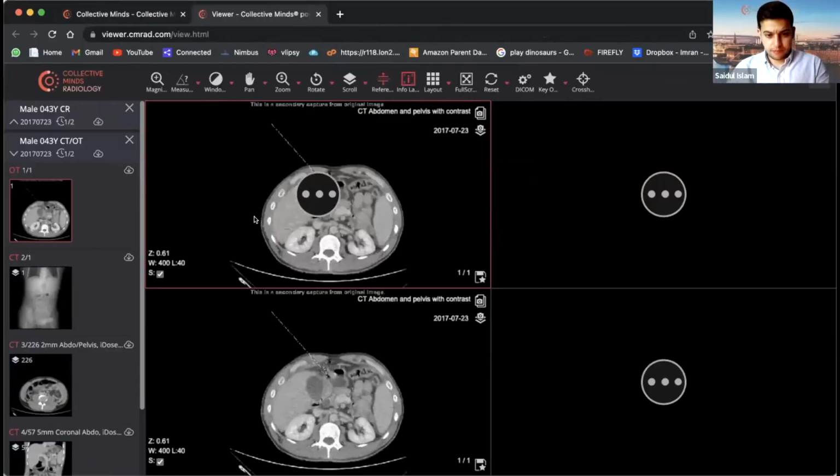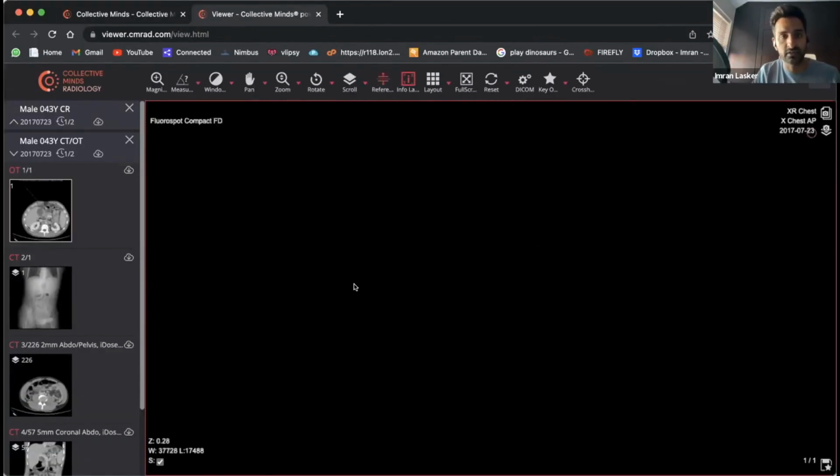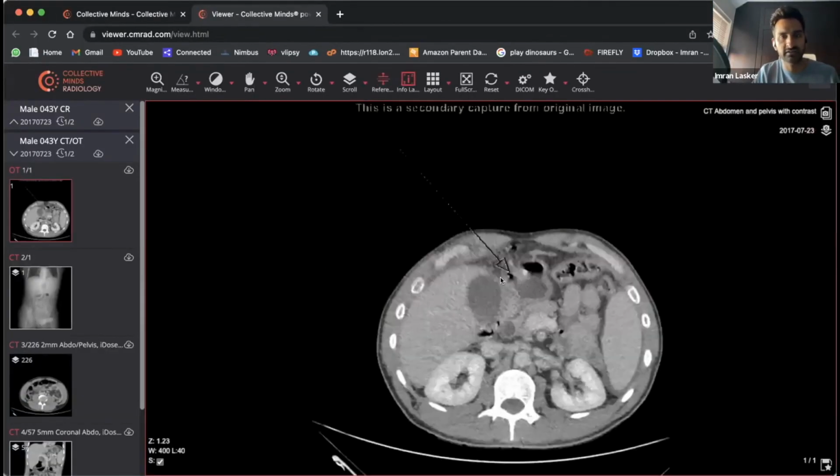Oh yeah, and for those of you that do want to go back and are worried as to where it was, there it is pointed out nicely for you if you do want to review and have a look at it later. So anyway, we've had a few good cases. We've gone through a bit of liver stuff, a bit of bowel stuff, and hopefully quite common findings. And if you go back from the beginning of this series to now, you'll pick up little nuggets of information that are hopefully building on a bigger set of knowledge that will help you later. I hope that's been useful for everyone.